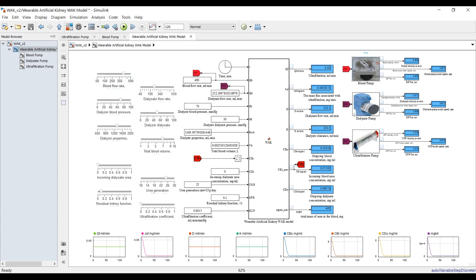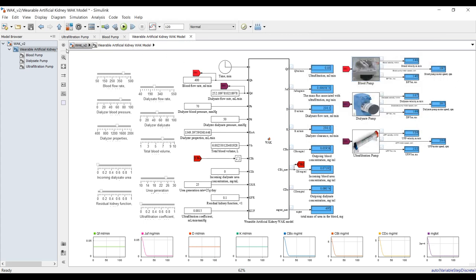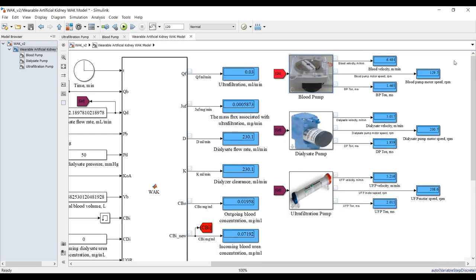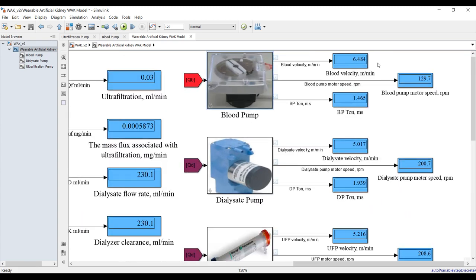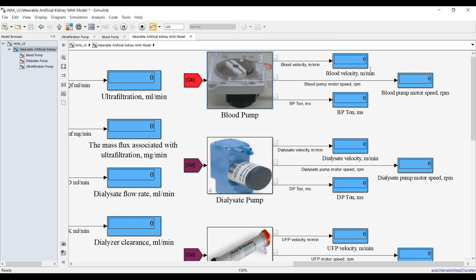Suppose I have a blood pressure input and I want to change the diameter — let's set it to 10 and see if it has the same effect or not. For the blood pump, let's see — yes, it produces a new design response based on the variation of your parameters.